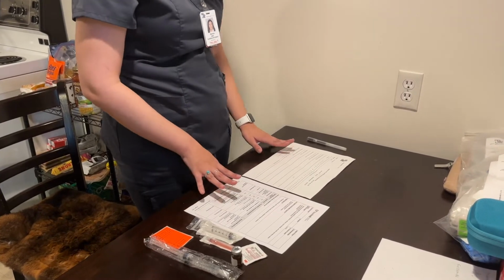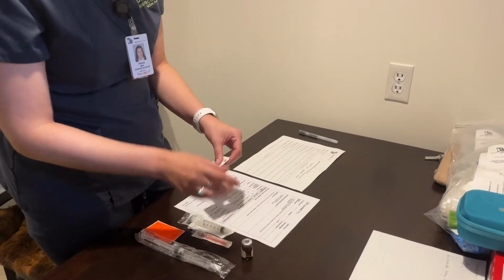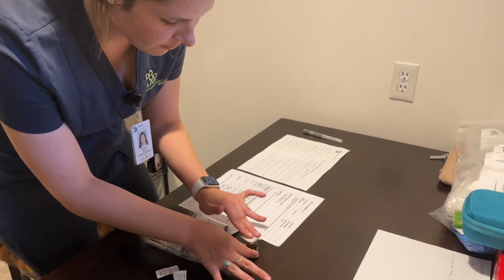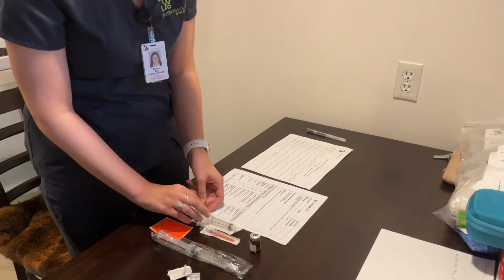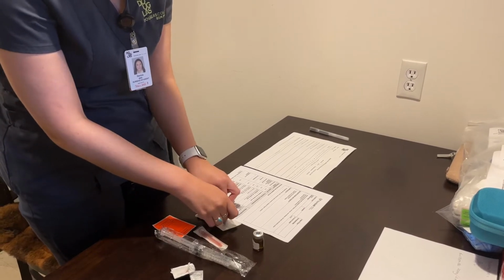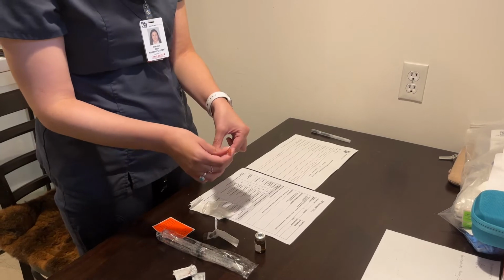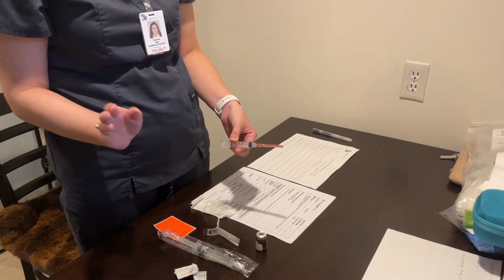Okay, moving on, we are going to now draw up the medication. So first things first, I'm going to alcohol swab the lid to make sure it is clean. Let that dry. Take out all my equipment. So I have my plunger and this. We're just going to put this on.